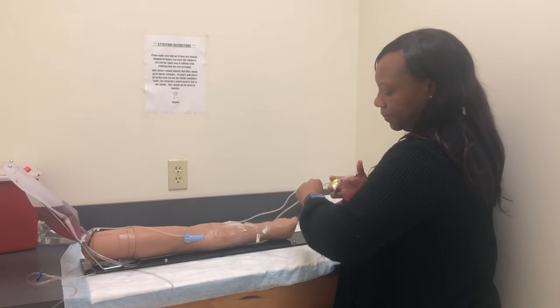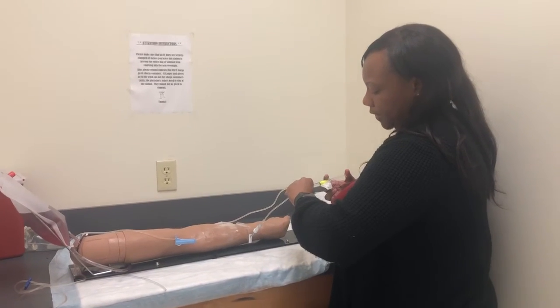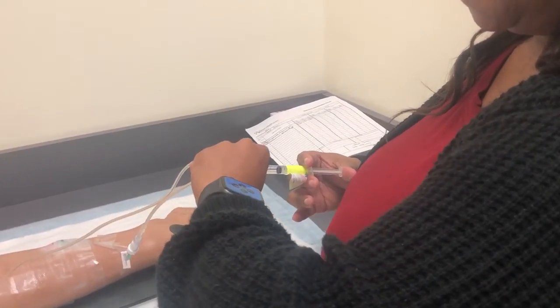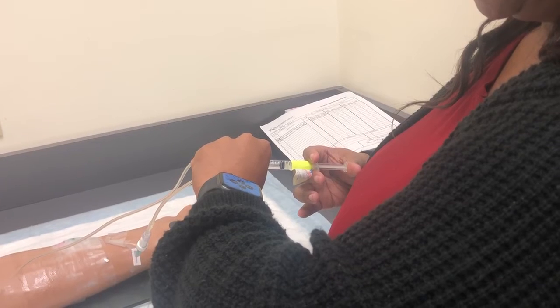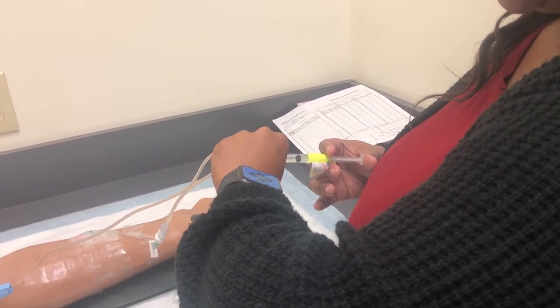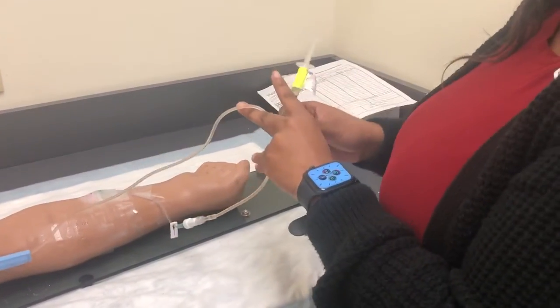Alright, I'm going to start and pinch and give my 1 and 1/2 over 30 seconds. Alright, I'm going to hold, release, and let the primary flow through for 30 seconds.